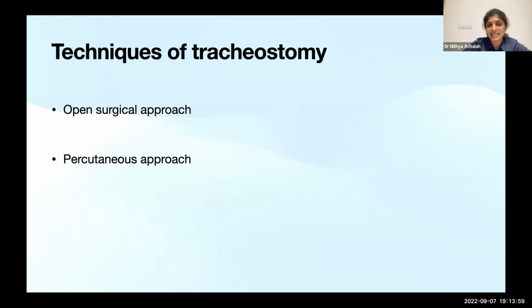So coming to the techniques of tracheostomy, there are two major techniques. One is the open surgical approach and the other is the percutaneous approach. The open surgical approach is done by the surgeons in the operation theater, whereas the percutaneous dilatational tracheostomy is done by the intensivist or the anesthetist at the bedside.